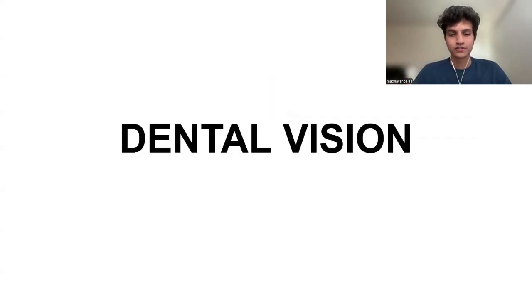Guys, we have developed a deep learning project called Dental-Vision. Oral diseases are surprisingly common, yet most people don't even realize they have one until it becomes serious. That really made us think, what if we could catch them earlier? Getting a proper medical diagnosis isn't always easy.